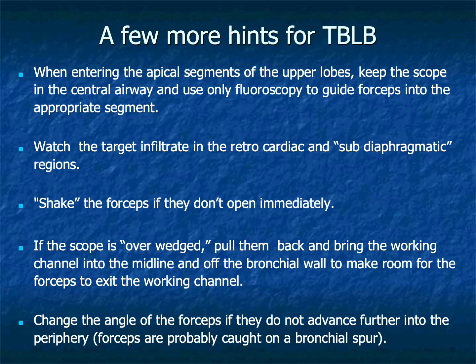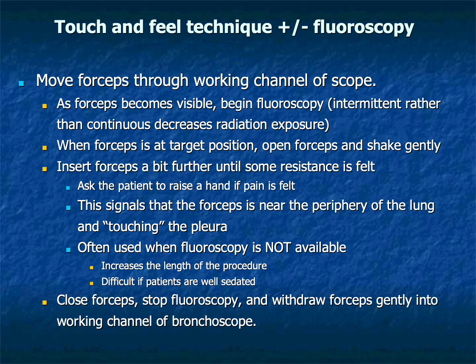A few additional hints are found on this slide. If the scope is over-wedged, try pulling it back and starting again to make the forceps exit the scope somewhat easier. A touch and feel technique may be used when fluoroscopy is unavailable. By advancing the forceps until subtle resistance or pleuritic discomfort is encountered, the operator estimates peripheral position before obtaining biopsy samples. Although useful, this technique generally requires greater experience and may prolong the procedure. Spend a few moments reading this slide carefully.